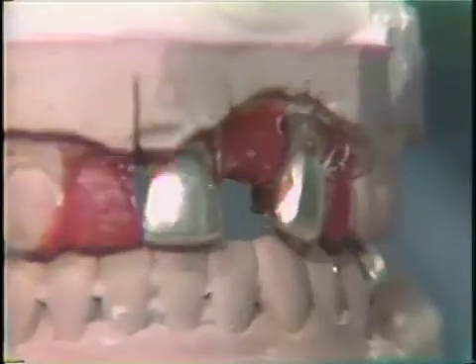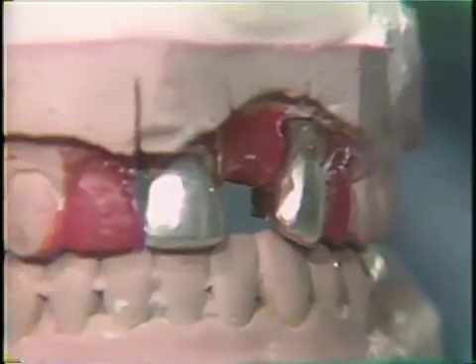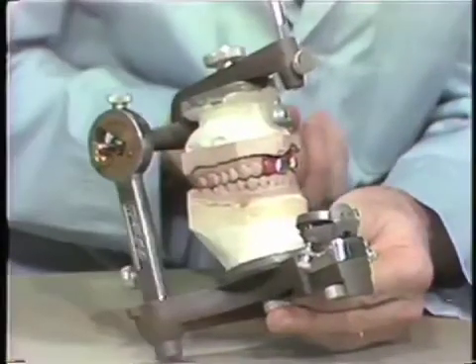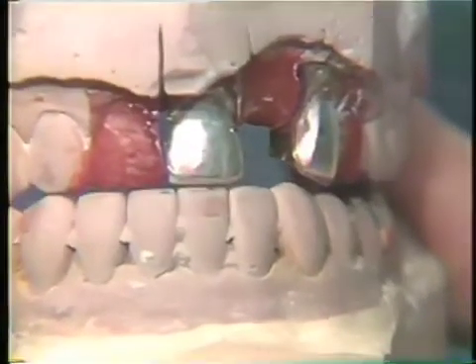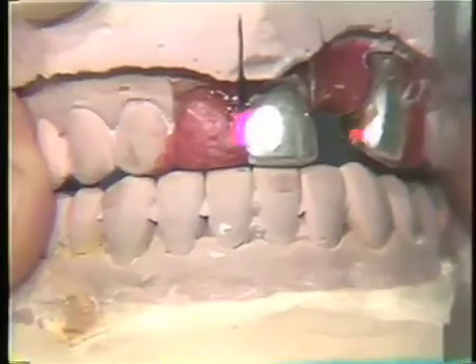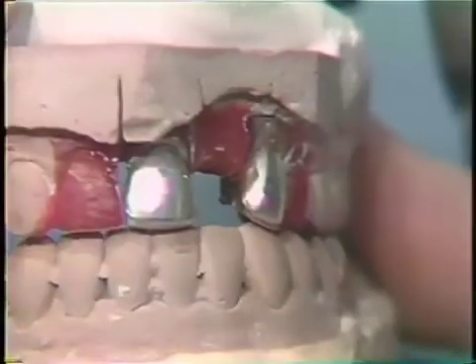If this is correct, there should be a centric relation and a centric occlusion stop. And if this is correct, then we will check the protrusive excursion. When we move the articulator into the protrusive excursion, the individual castings should not be high. If they are, they should be adjusted.